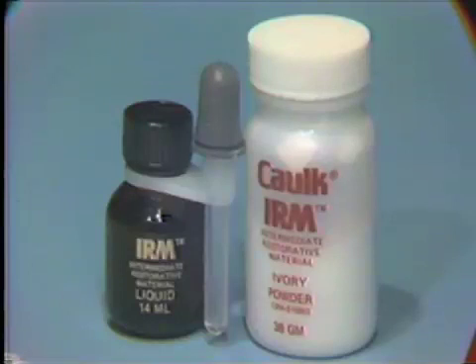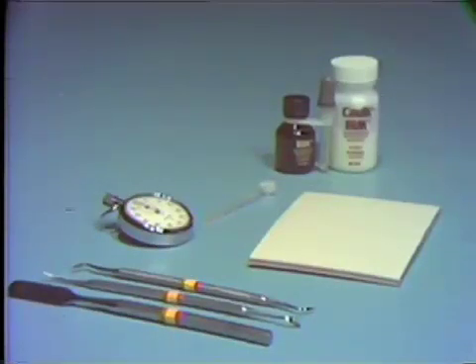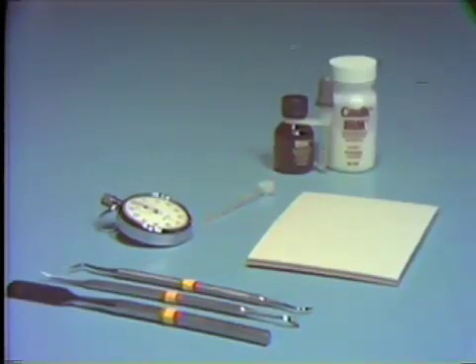The primary use for this material in dentistry is for long-term temporization or as an interim restoration during prolonged operative procedures. The armamentarium required for mixing includes the IRM powder and liquid with a dropper for dispensing the liquid onto the pad.